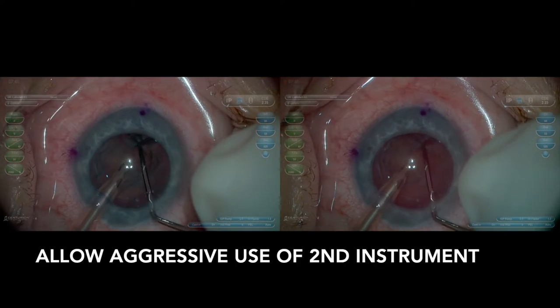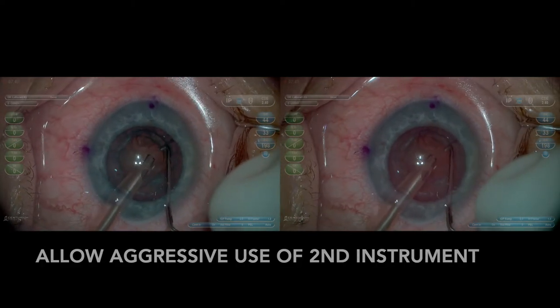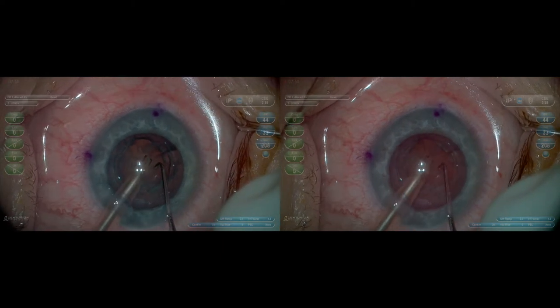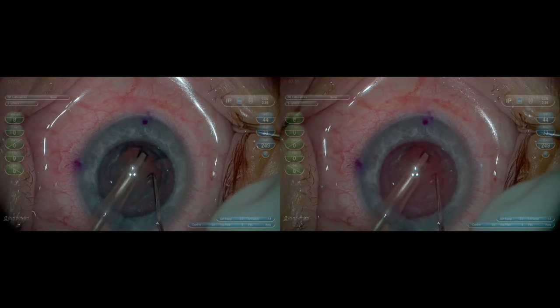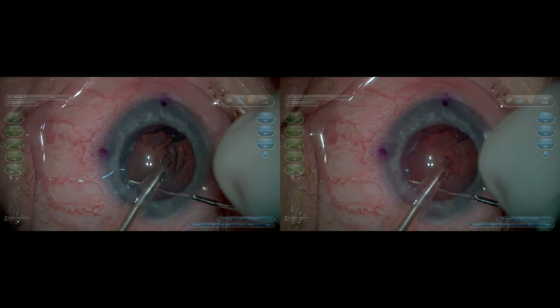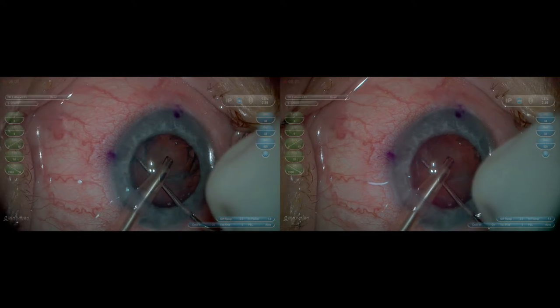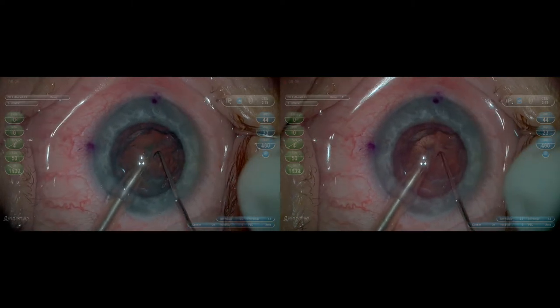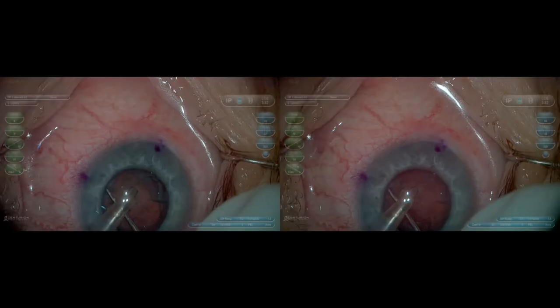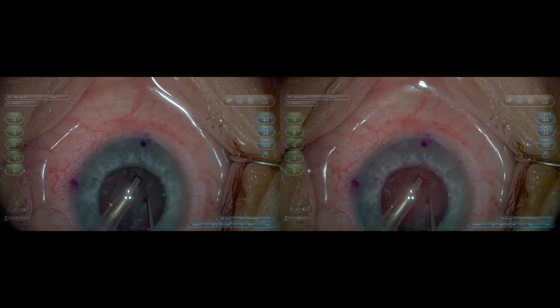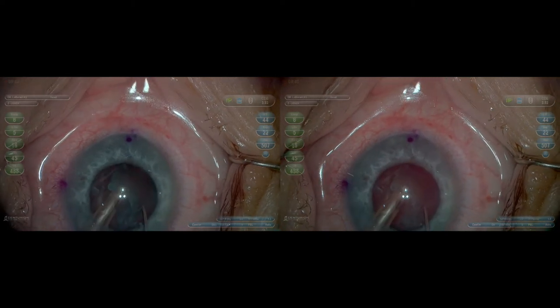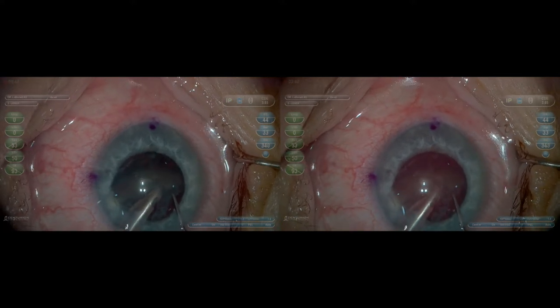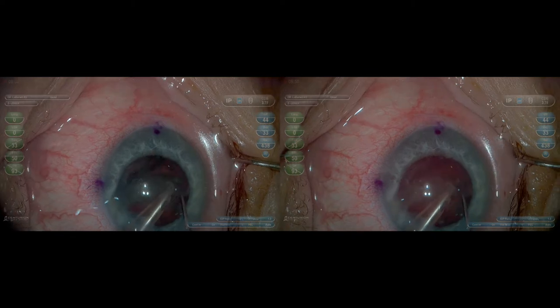I've removed the lens and now in my use with femtosecond, I'm very aggressive with my second instrument. Because I have extended depth of focus, I'm more confident as I'm reaching into certain areas. I can see where my instrument is. I'm very aware of the posterior capsular position and where the anterior capsulotomy was created, especially because it was so consistent in the femtosecond treatment.